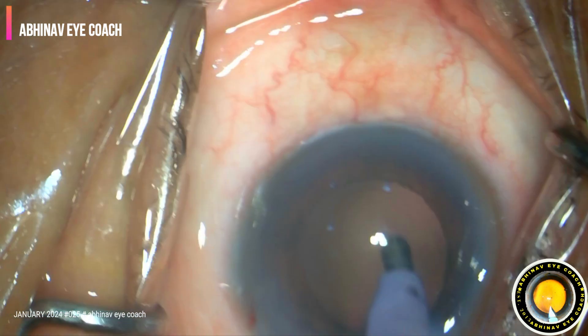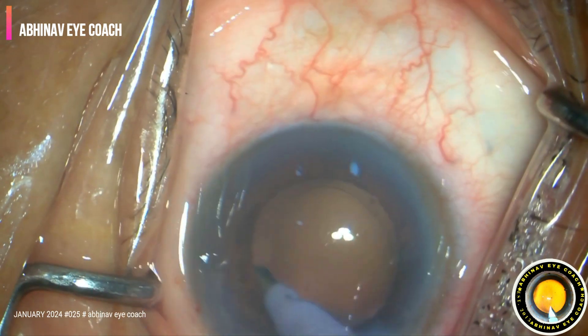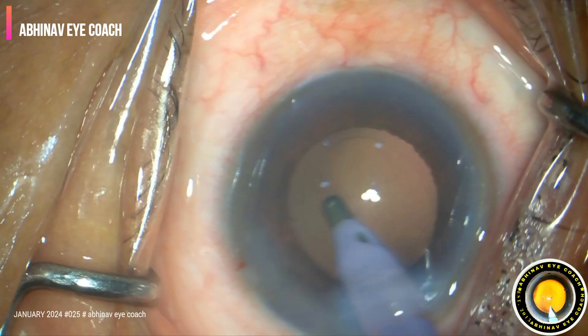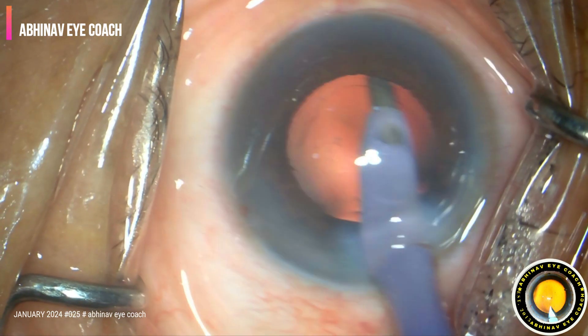The aspiration port of this probe should always be visible — it should not go out of your sight at any step. The irrigation aspiration should not be blind. The polishing is done.